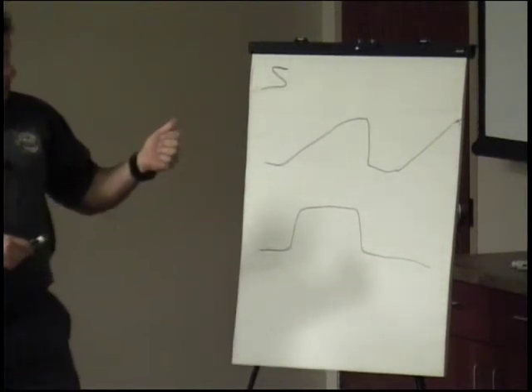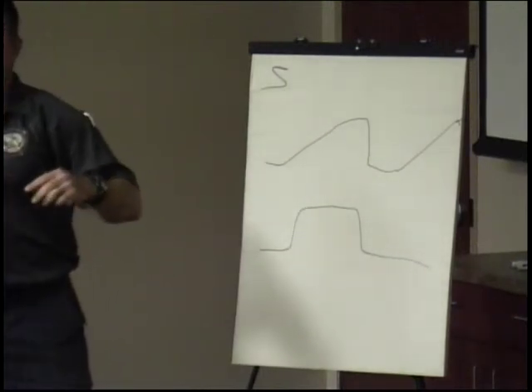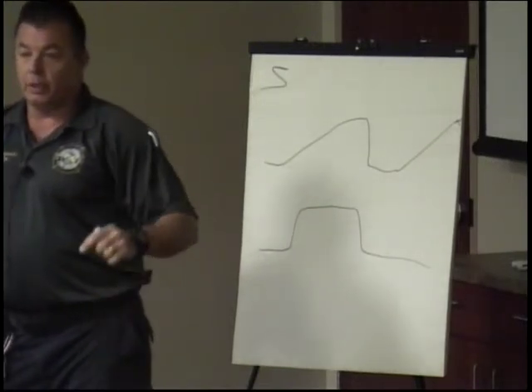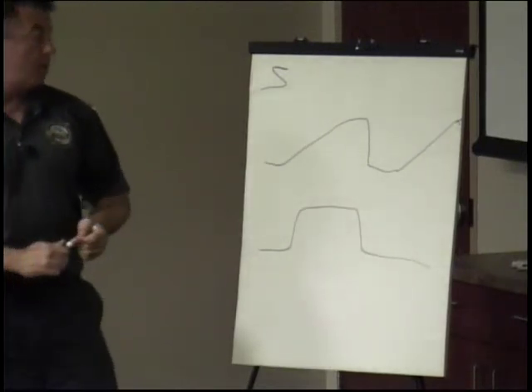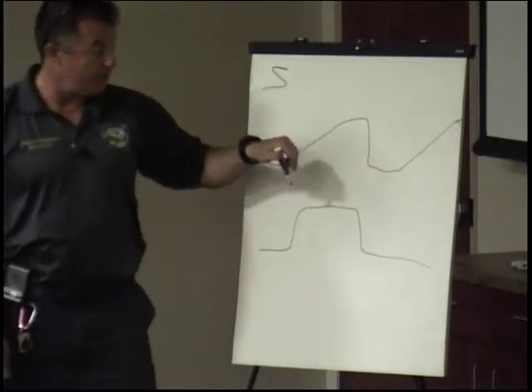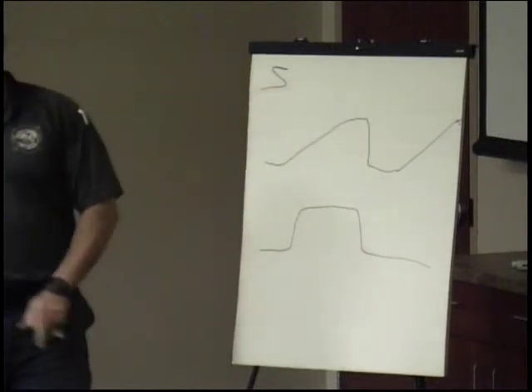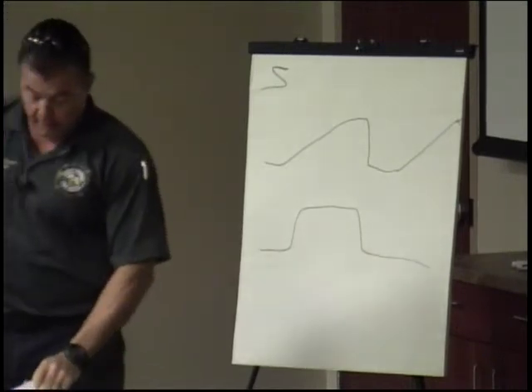And mild asthma can drop their CO2 initially, and then as they progress through that event, they can go back to the normal range, and then severe asthma, they'll have a higher CO2. So you've got to watch that in your asthma patients. And as you treat, you give them albuterol, whatever it is you're giving them, you can get rid of this notch and take them back to a normal waveform. So you can also see your treatment working in their waveform. You can treat them and get rid of that shark fin.